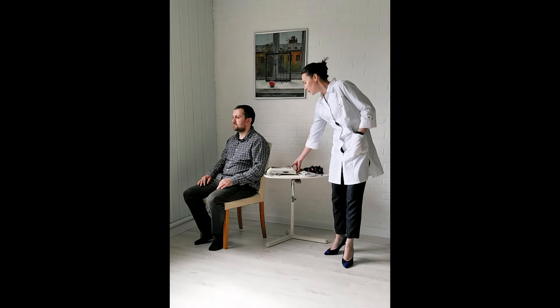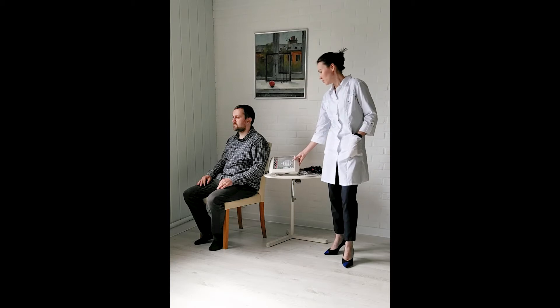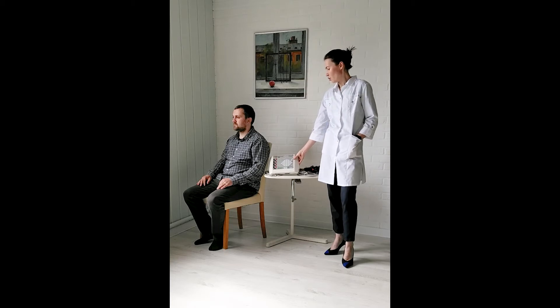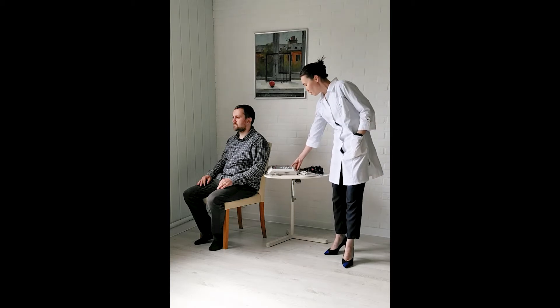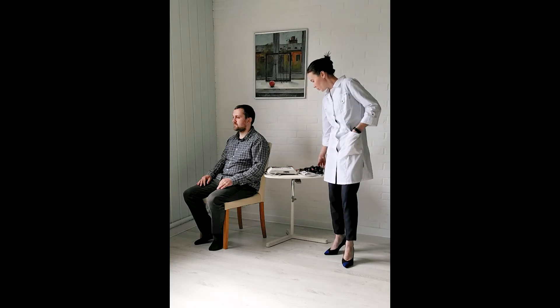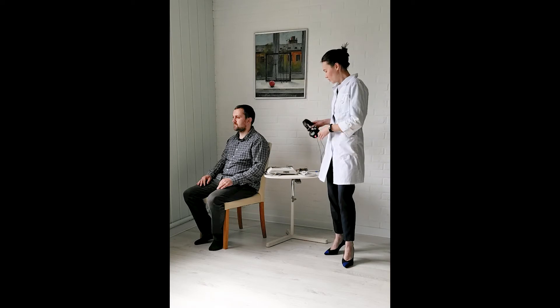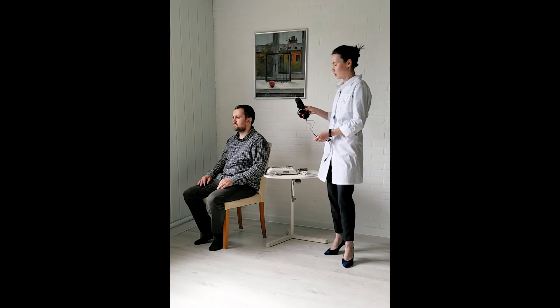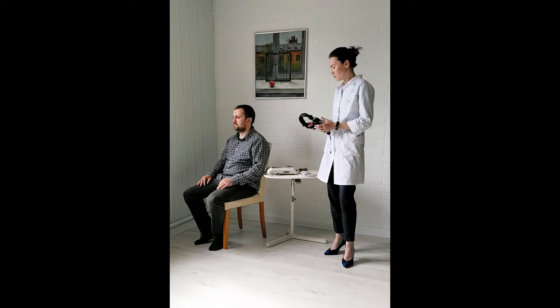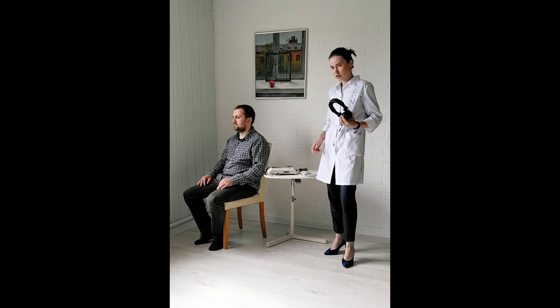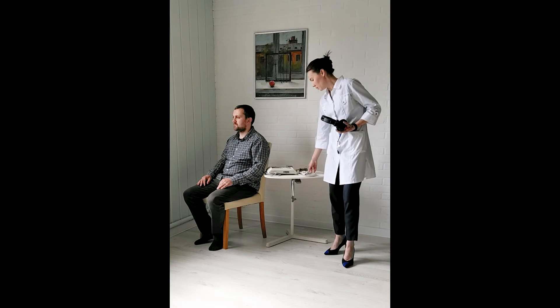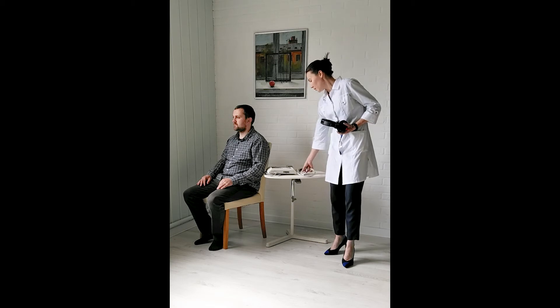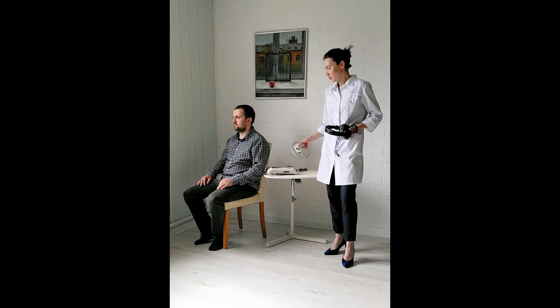We will use Neuron Spectrum 4 EPM device. Also, we need the headphones to deliver different types of stimuli and the patient button.